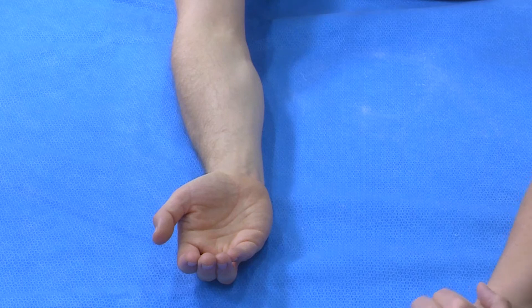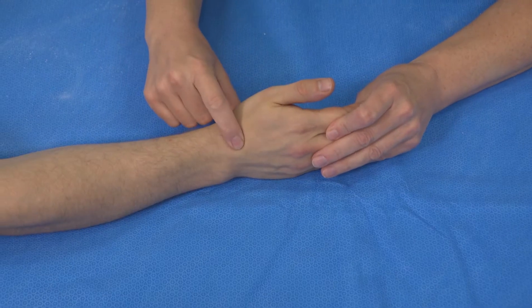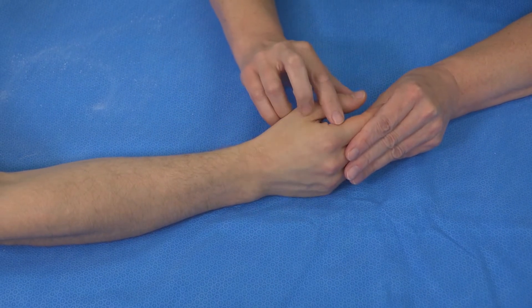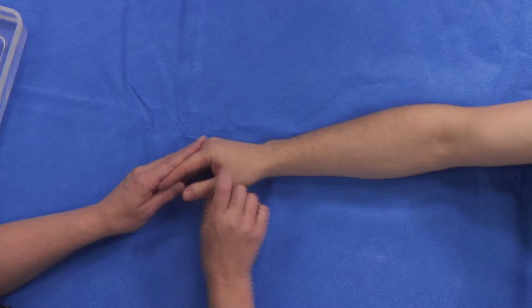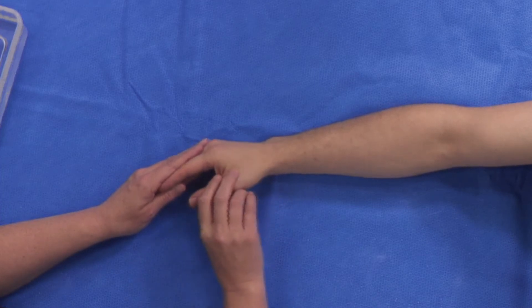When we're casting the hand into this position, what we're aiming for is for the wrist to be in slight extension, the MCP joints to be as close to 90 degrees as possible, and the PIP joints to be straight. If you're casting the thumb separately, then the thumb needs to be abducted away from the hand, but in most cases the thumb will be allowed to be left loose.